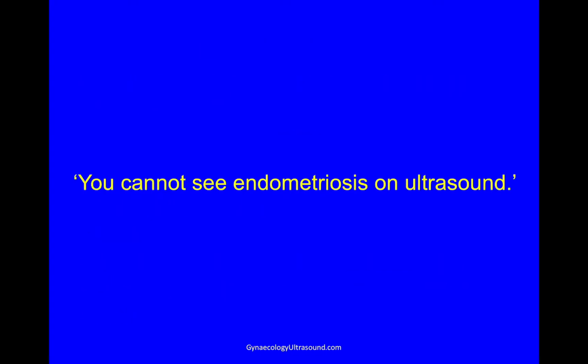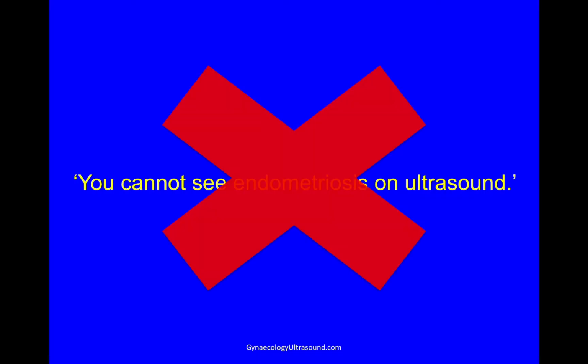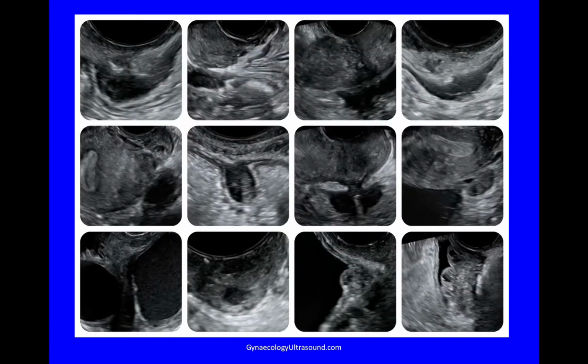But also, there's a myth that you cannot see endometriosis on ultrasound. This is just not true, and I hope to show you how. These are some examples of deep endometriosis that was easily seen on ultrasound.